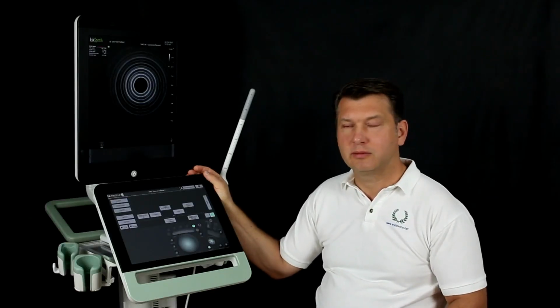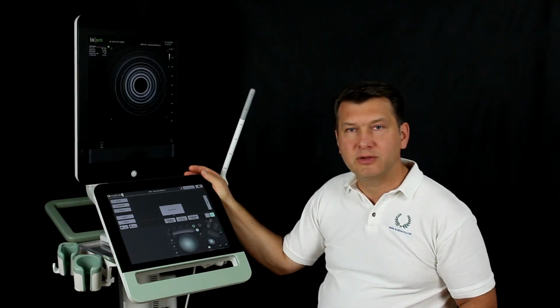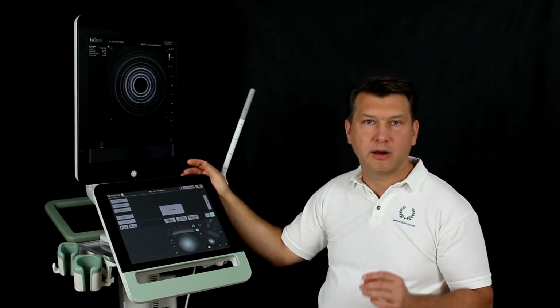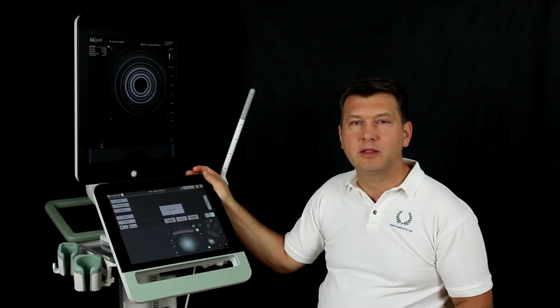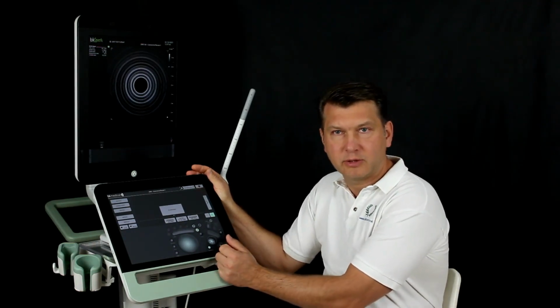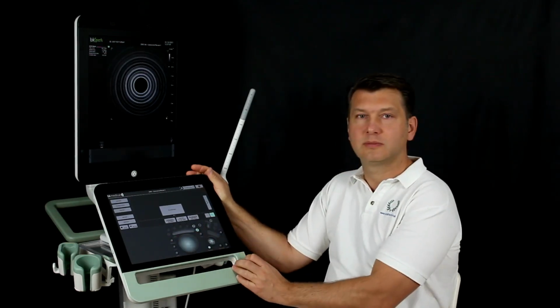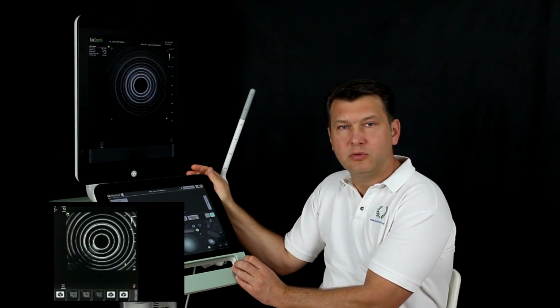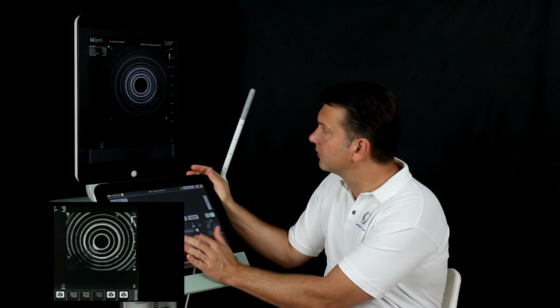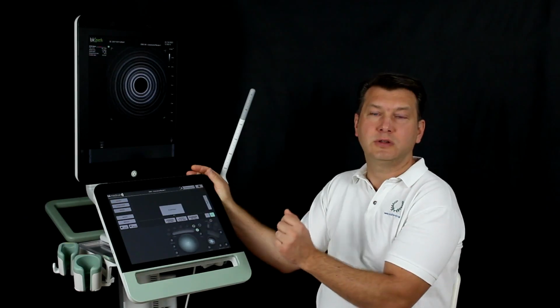Then we press the 3D button, which is just here. Here we have to make sure that the 3D frames capture the areas that we also want to examine. We can adjust this area manually. For that purpose, we slide our cursor onto a corner of the frame so that it appears yellow. Then we click the cursor and move the frame as we need it.